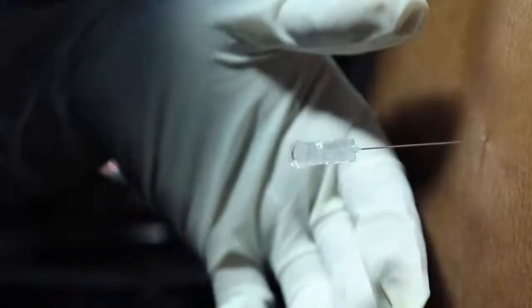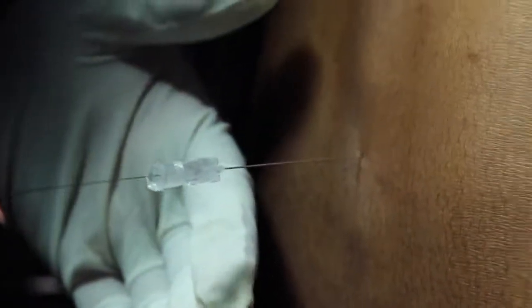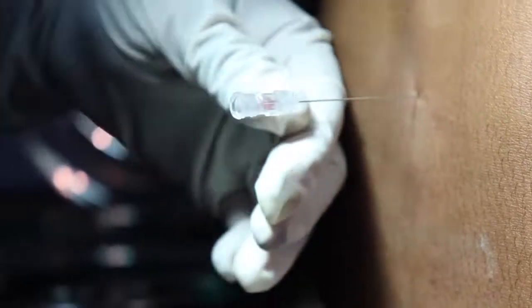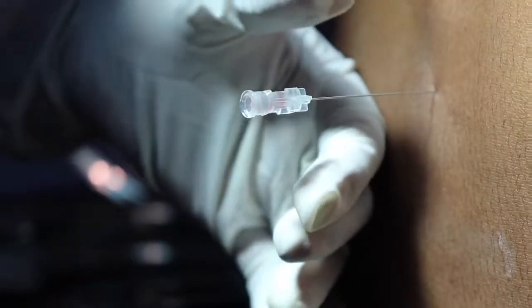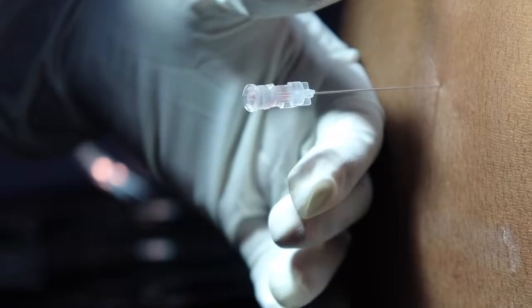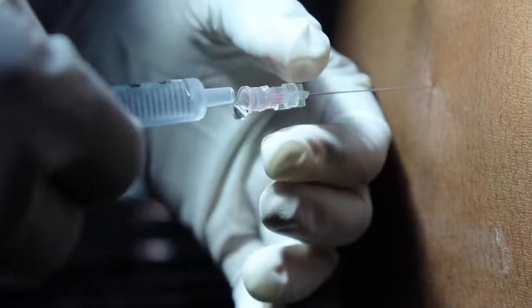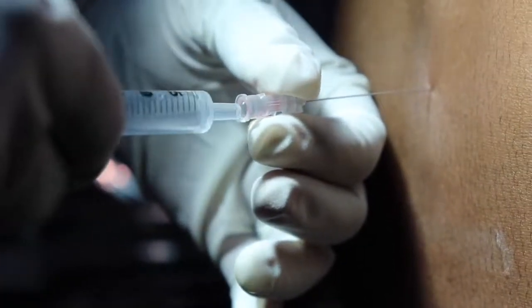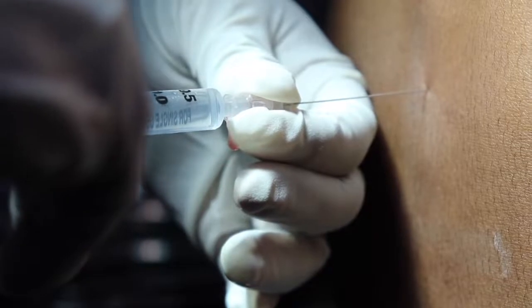Once the anesthetist feels a loss of resistance, they will check for CSF leak — and there is a slow CSF leak here. The needle is advanced further into the subarachnoid space and CSF flow is confirmed again. Once there is confirmed flow of CSF into the needle hub, the drug is administered. The anesthetist reconfirms by aspirating to check that CSF is coming easily, then injects the medicine into the subarachnoid space.